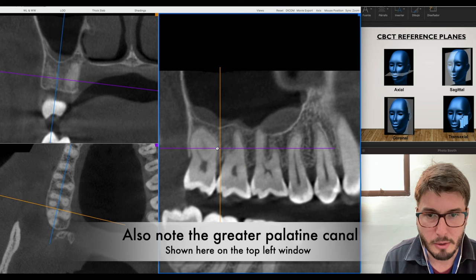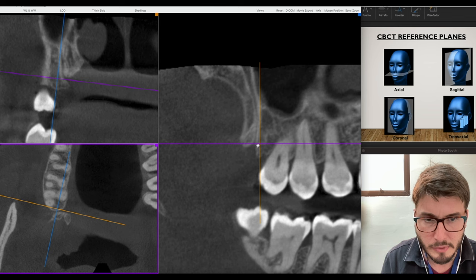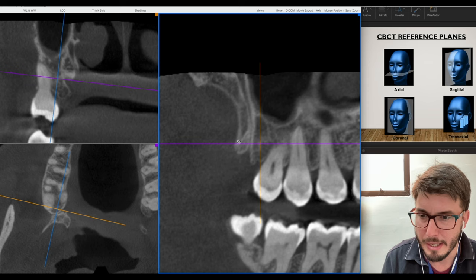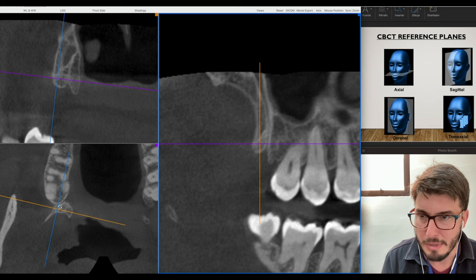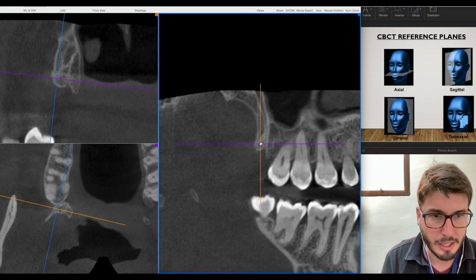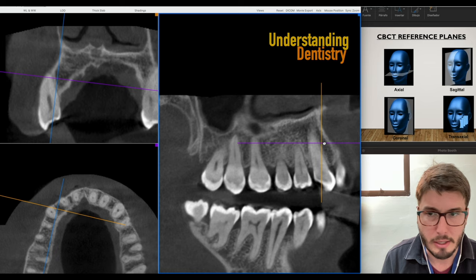Here are the second and third molars, and then the tuberosity of the maxilla. After the tuberosity, the pterygoid process — lateral plate and medial plate — just as we saw in the axial raw images. The maxillary sinus is visible in the three planes.